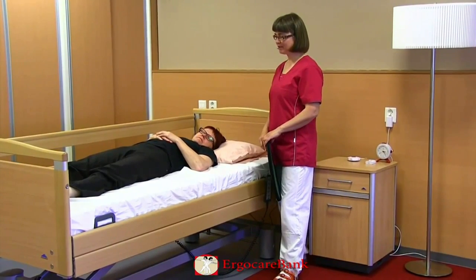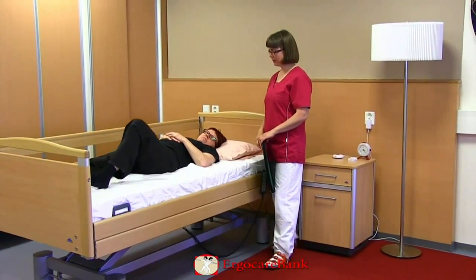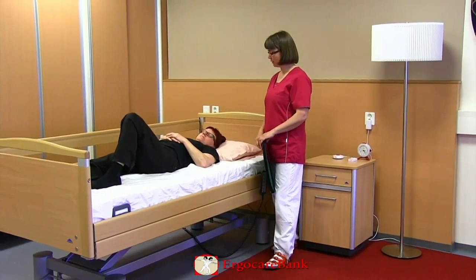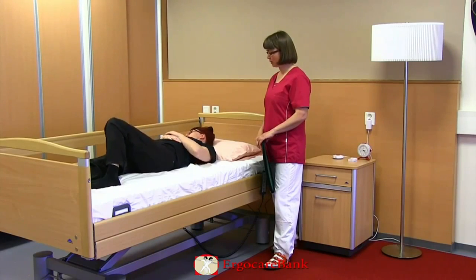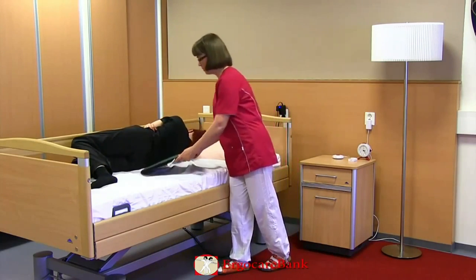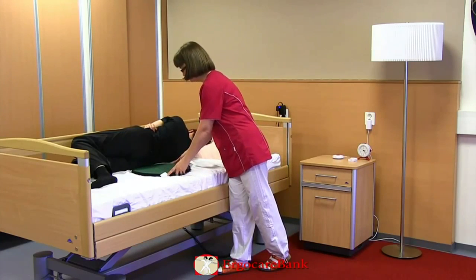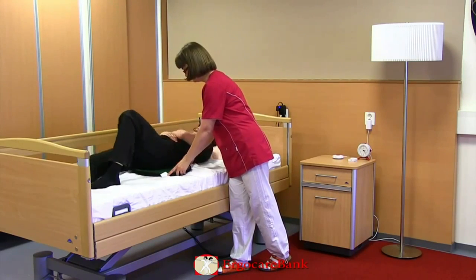The staff member asks Amanda to bend her left leg and roll over to her right side. She then places a turning disc so that when Amanda rolls back, the disc is under her bottom.